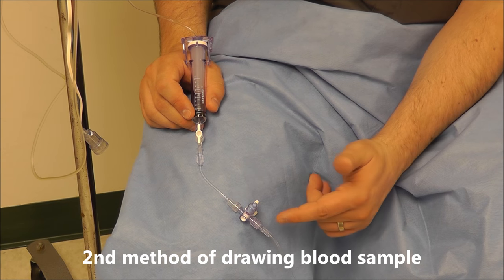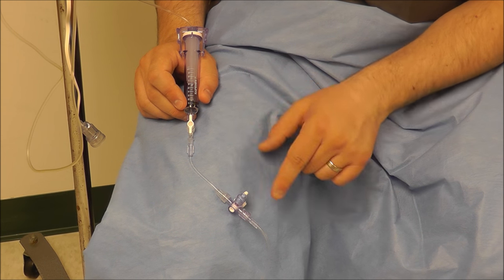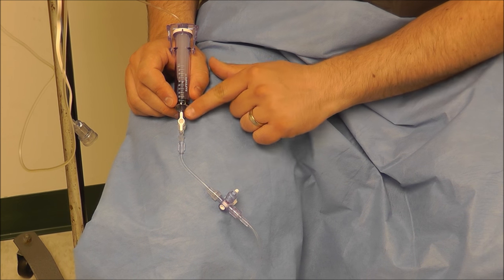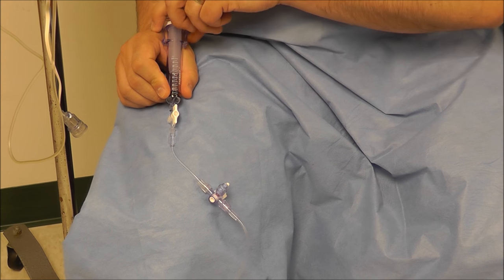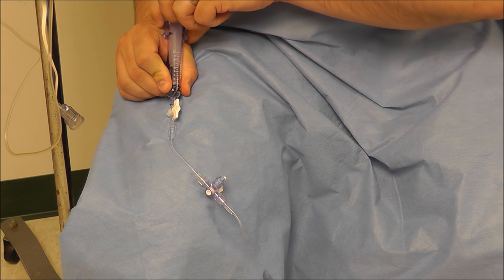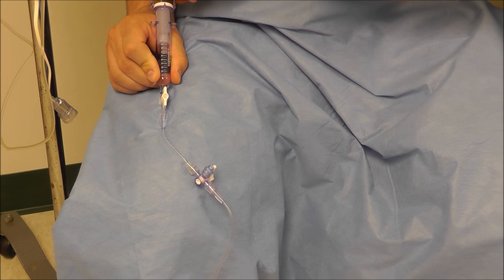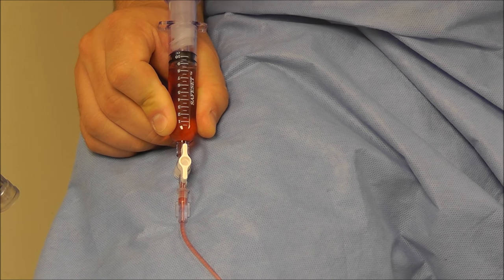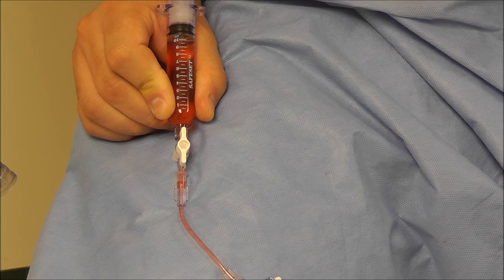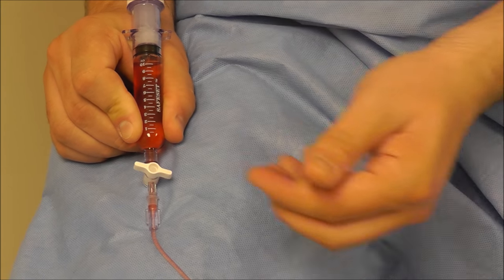The second method we can use for drawing our blood sample from our art line is this built-in plunger set. We want to make sure that the stopcock right in front of the plunger is parallel. Once it's parallel, we're able to draw back on the plunger and on the syringe, and pull out all that saline that's in line so our sample is not diluted. One of the things about this plunger set is it eliminates the need for the 10cc syringe like we saw in the first method.